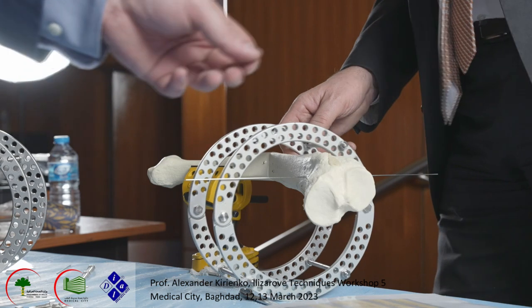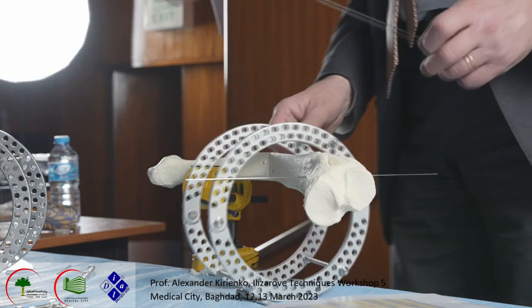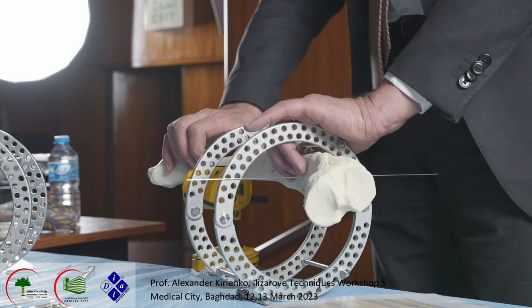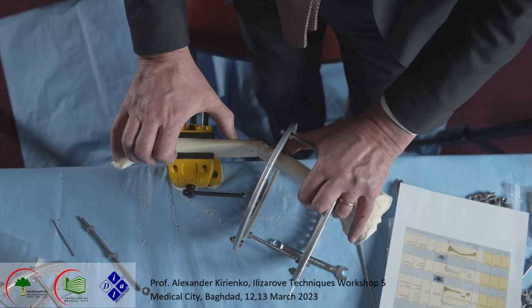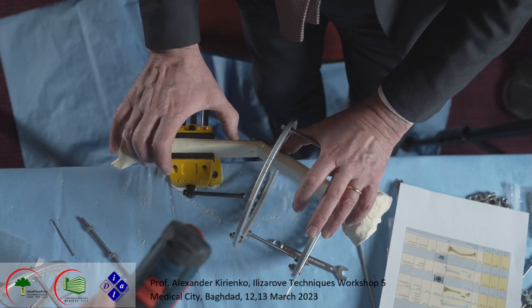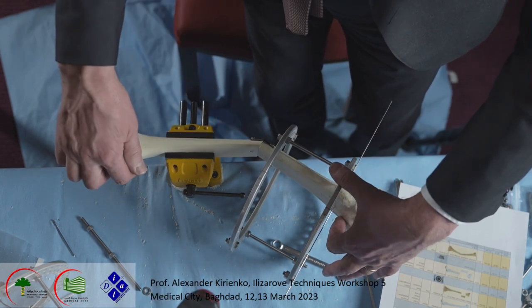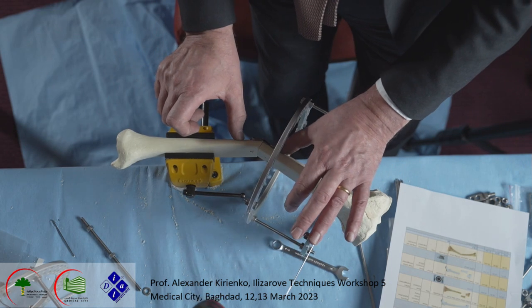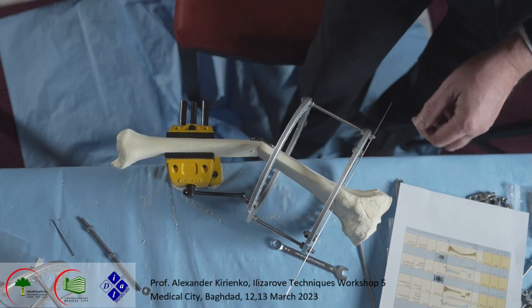Because like you see, there is a varus deformity. What we need to have here is a support, because we do a correction with two pushing forces: one from the lateral side, and another from the medial side distally. But in the middle of the fracture, there should be support from the lateral side.